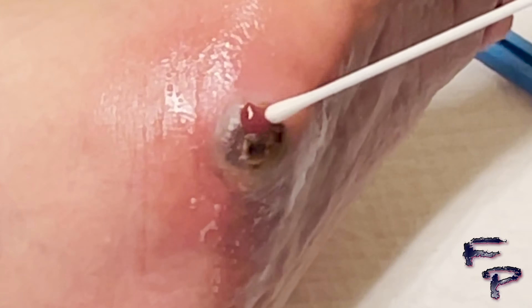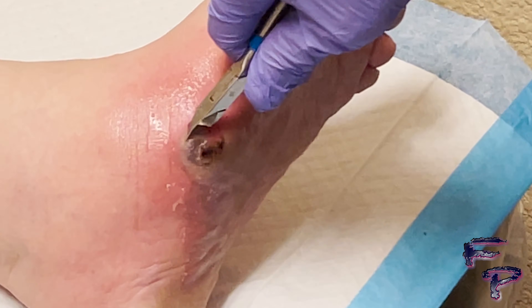Once a culture is obtained, utilizing either a 15 blade, pickups, or tissue nippers can be used to de-roof the blister entirely. Everyone performs this differently. Normally, I like to go along the furthest edge using a tissue nipper.